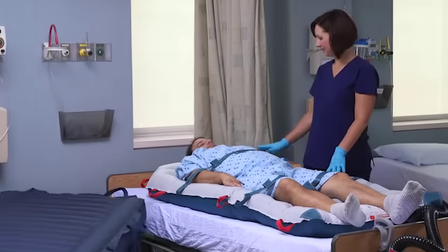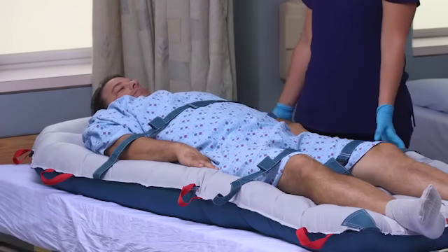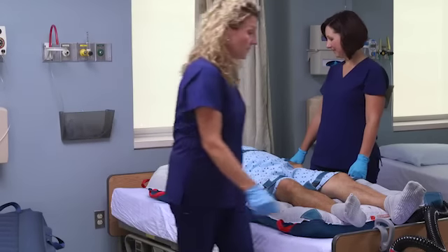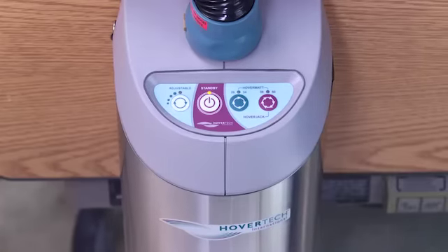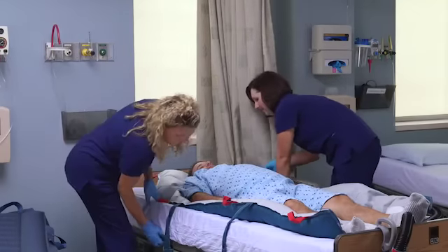Ensure that the patient is centered on the bed or stretcher prior to deflating the HoverMat. Assume the position of safety, advise the patient of the deflation, and press the standby button on the air supply to turn off airflow. Raise the side rails when deflation is completed.